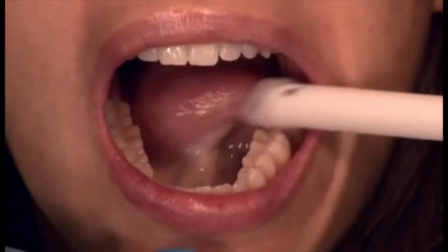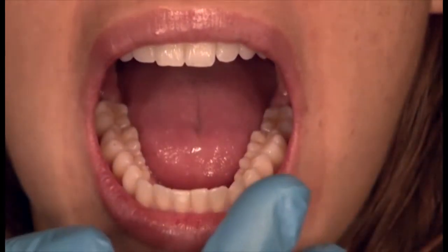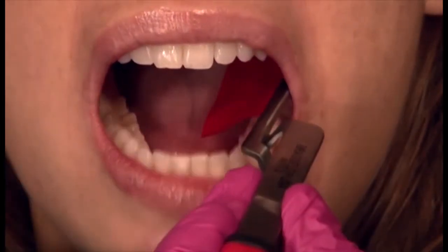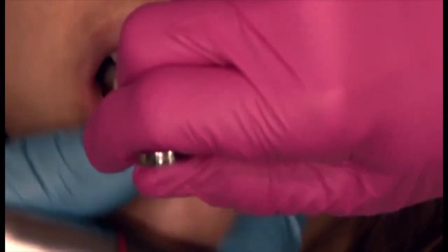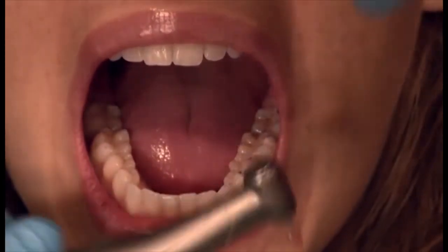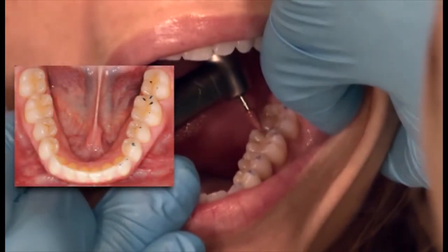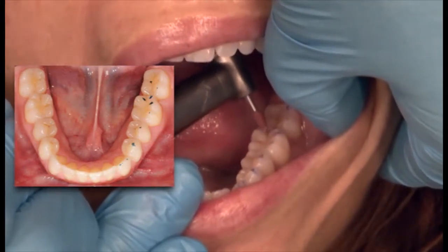Anytime I'm not sure, one of the things that's a really good idea is to use the red paper followed by even the blue paper and switch the colors back and forth. So let's double check. We'll go red. Let's go the blue. I want to see the blue marks. And if the blue marks are right with the red marks, you can see this is starting to work very nicely. You can see how the central fossas are starting to line up. This one is a little bit on this lingual incline. I'm going to take this one off on the lingual incline.